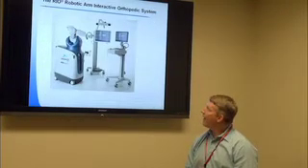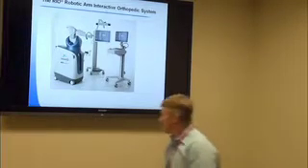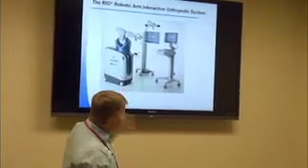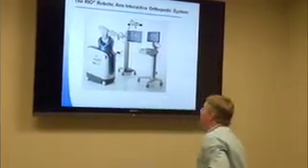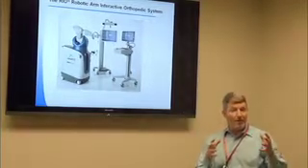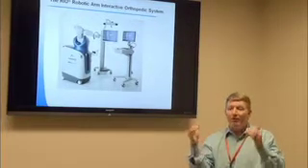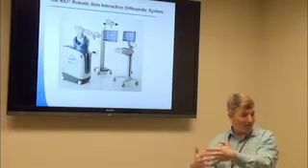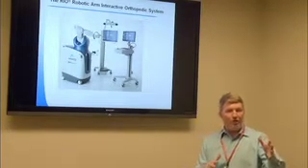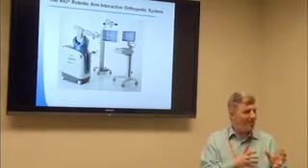This is the robot. And what I'll do is point out to you what I'm looking at in surgery. The robot itself is this here. The monitors that I'm looking at as the surgeon, the monitor in the back here. The computer system here is run by one of the technical engineers that program the CT scan and incorporate that image into what we're doing with the robot. So the CT scan is plugged into this computer system, and prior to surgery, prior to you going to sleep with your anesthesia, I know, and the engineer already knows, what your knee is going to need based on what your CT scan showed me.